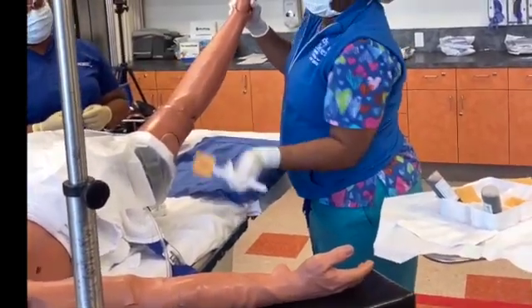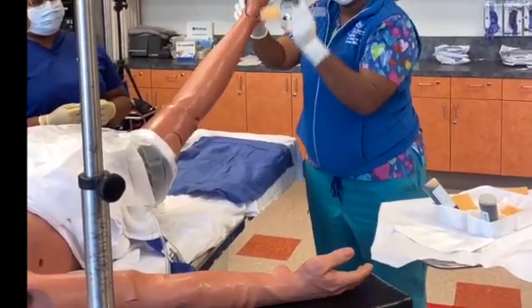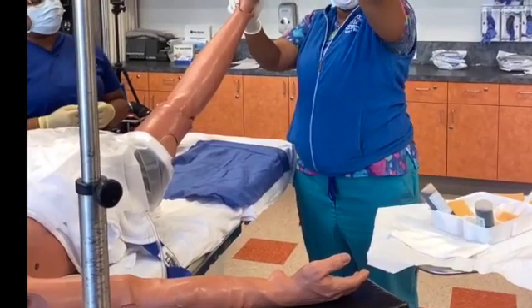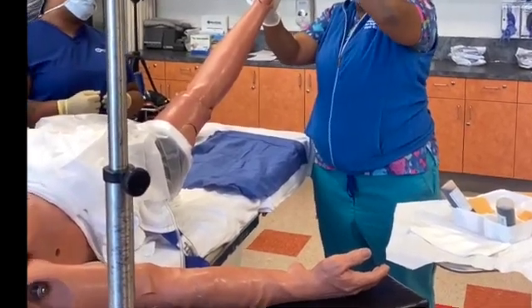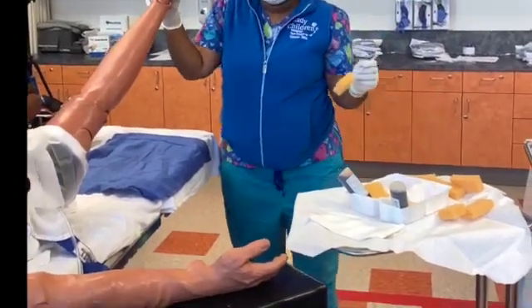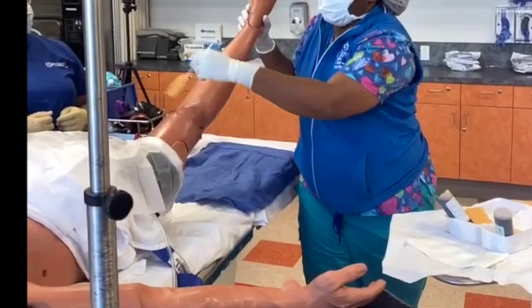Now I'm gonna paint. We have 3. So you guys see that motion? I'm kind of squishing it, get in between those toes, discard. And if you notice, what do you notice about my arms? How close is this to my body? Close.